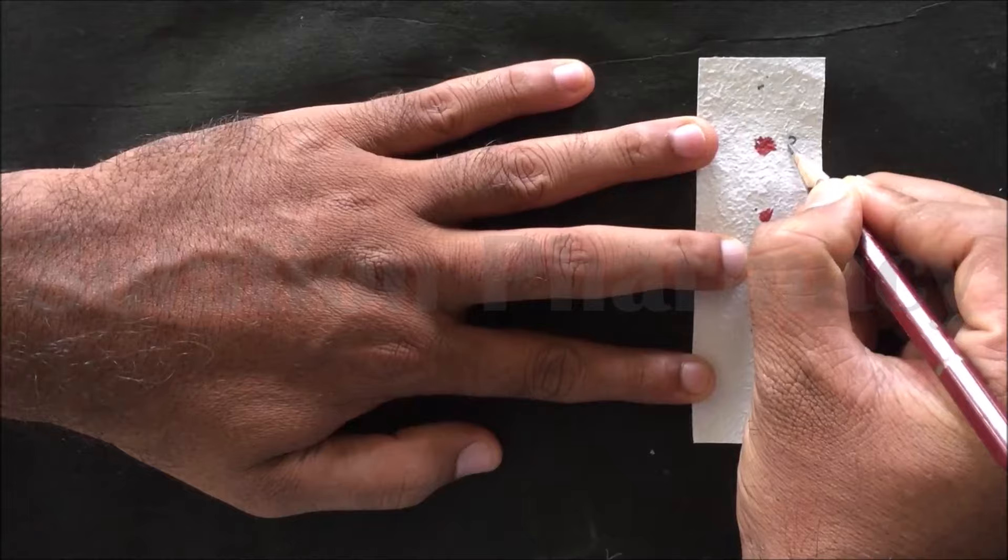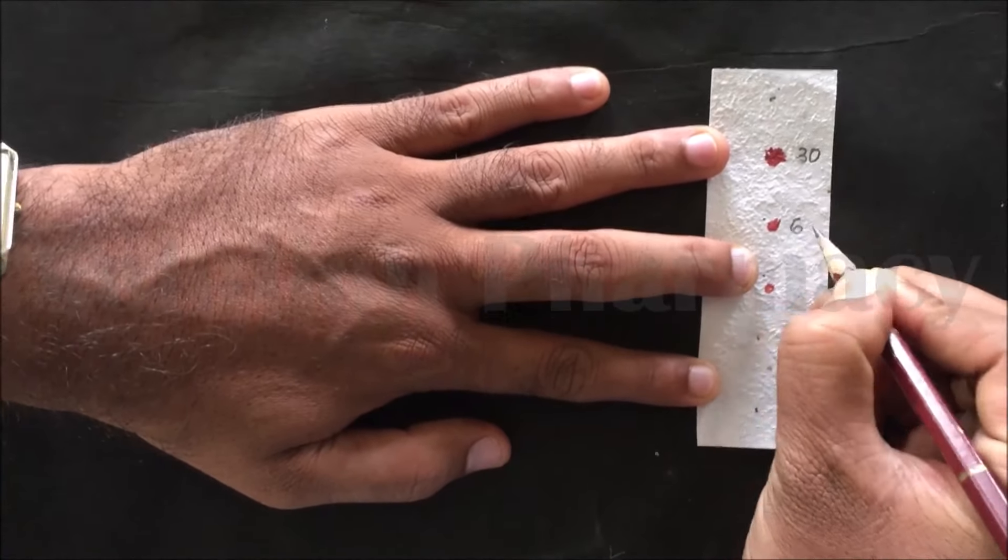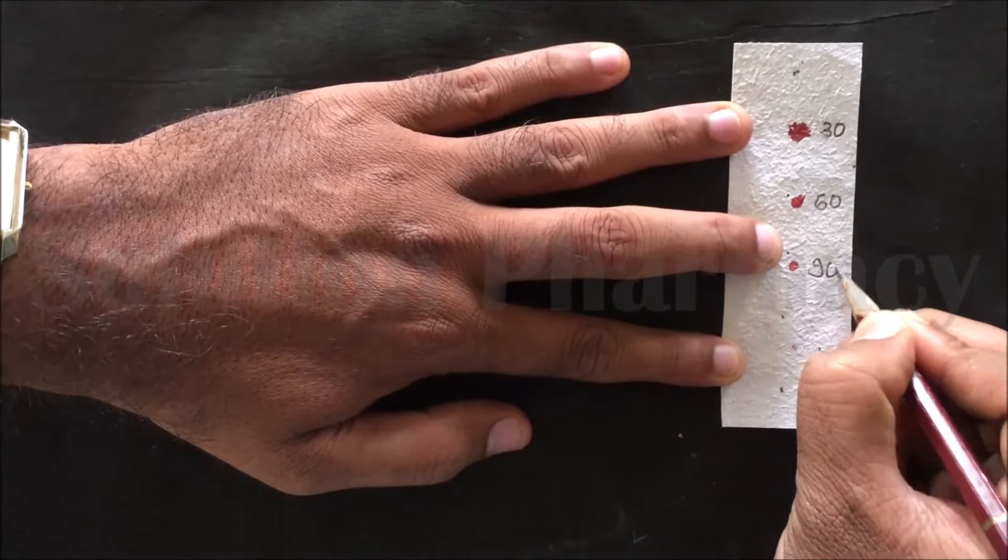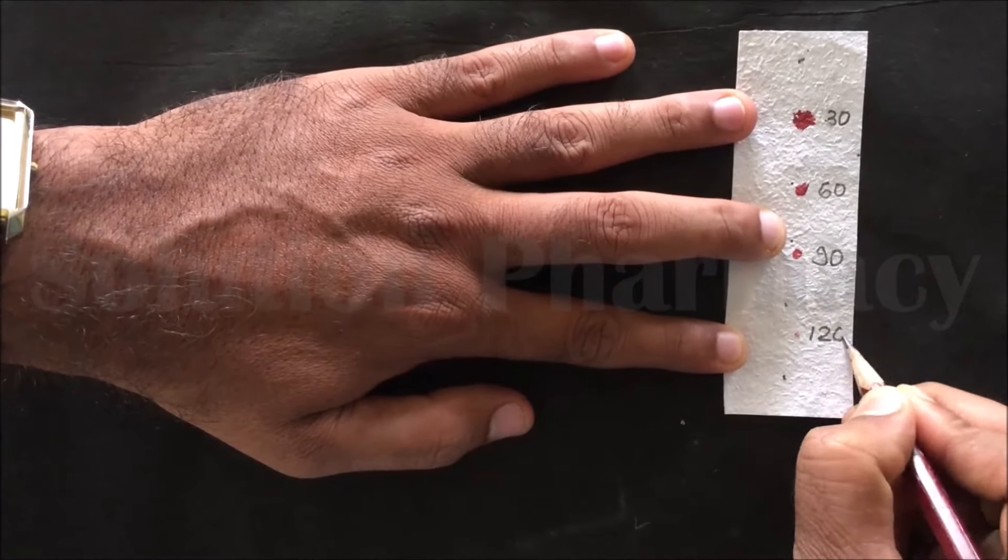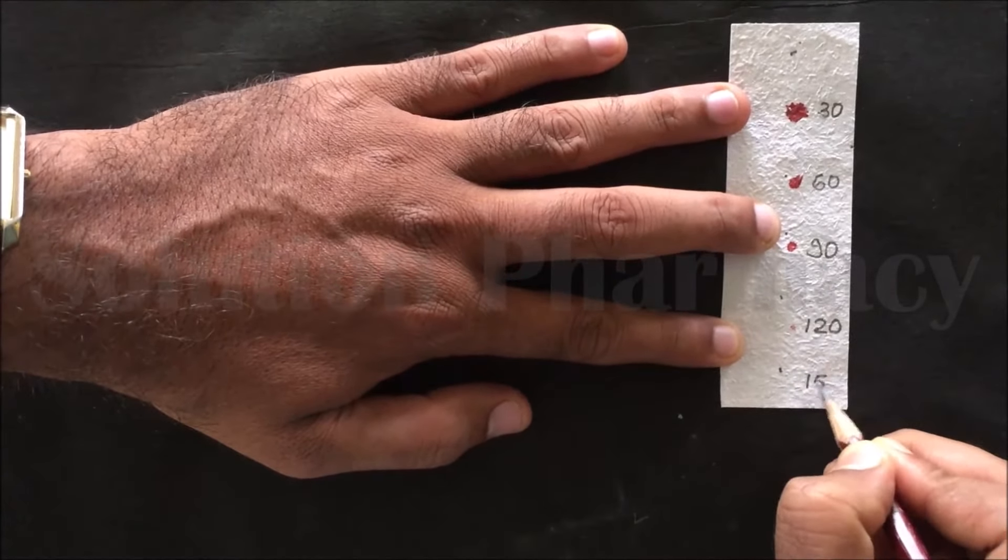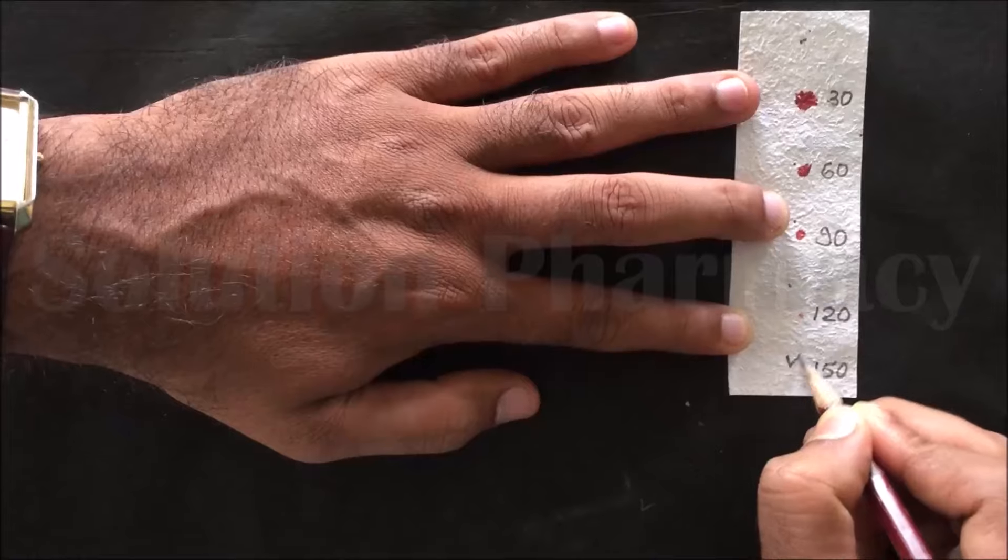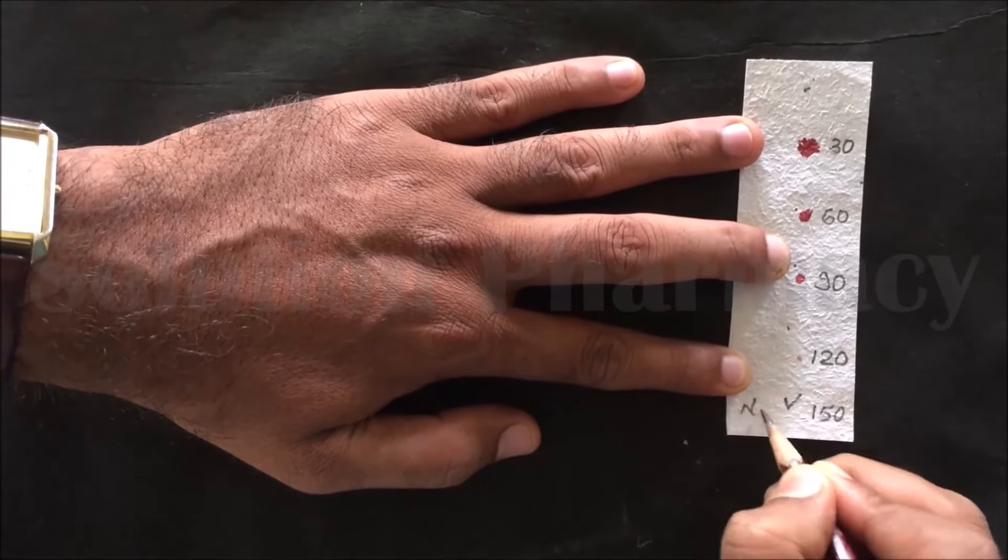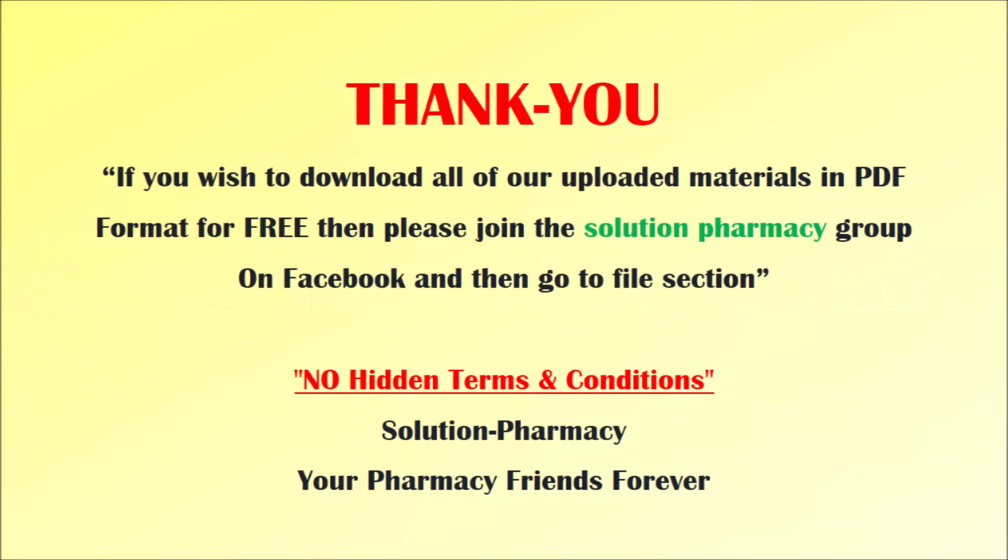Mark each spot of blood with the time after which we had applied it on the filter paper. Here the total time is 150 seconds. 150 seconds is the bleeding time, then express the bleeding time in minutes and seconds. Thank you very much for watching this video.